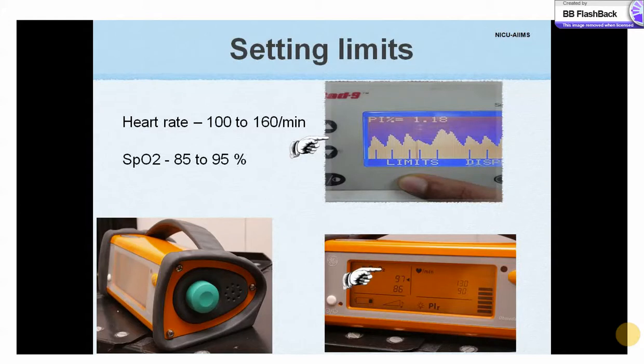Setting alarm limits is an important aspect of monitoring. In neonates, we usually set the saturation between 85 to 95 percent and pulse rate between 100 to 160 per minute. Limits can be set using these buttons or these knobs at the sides to choose the appropriate component and set as per the clinical needs.